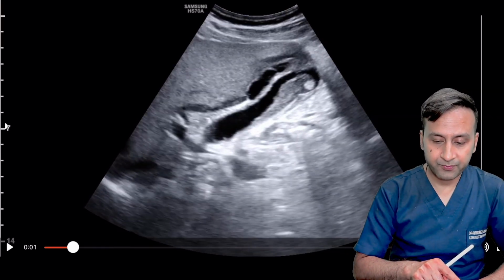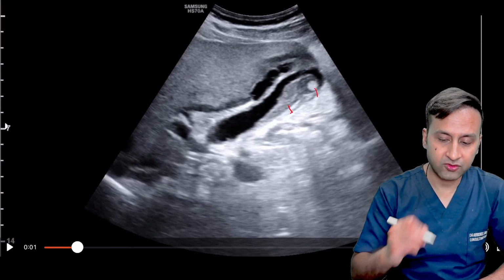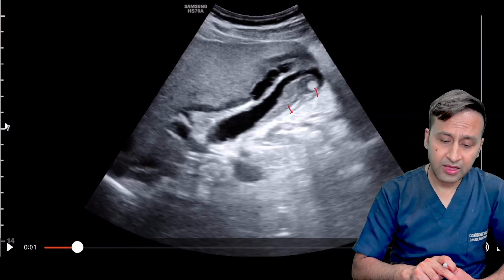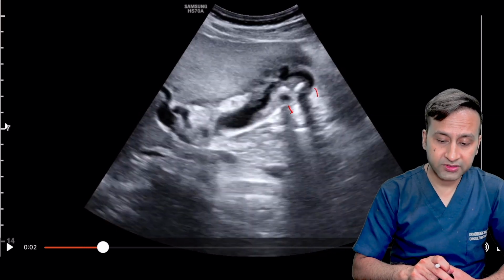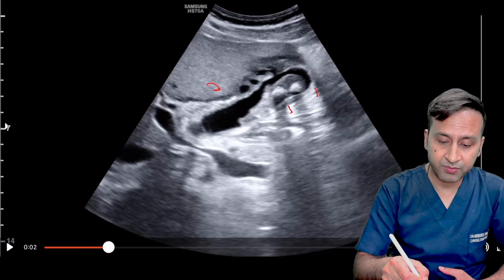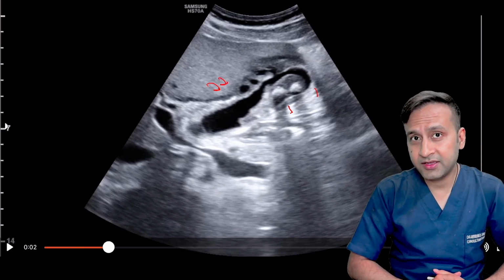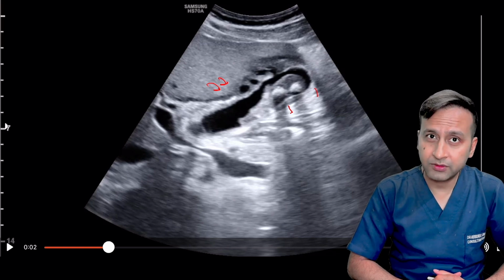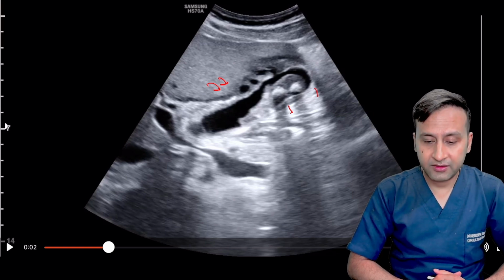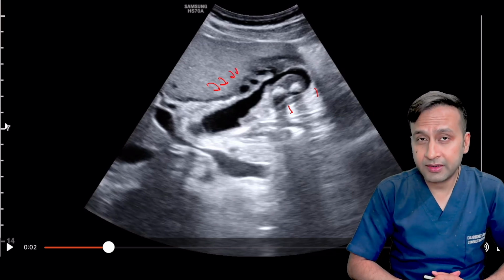What do we see here? We can clearly see that the gallbladder contains some calculi. It also contains sludge. Now, what is more important is the wall of the gallbladder. So if you see the wall of the gallbladder along the anterior aspect, can you appreciate a clear-cut fat plane which is dividing the gallbladder from the liver? No, there is no fat plane. The gallbladder wall here appears inseparable from the adjoining liver bed.